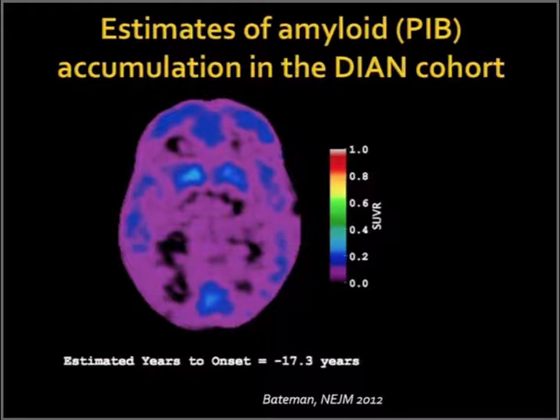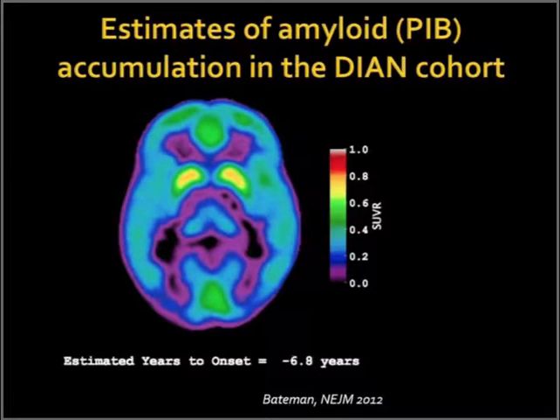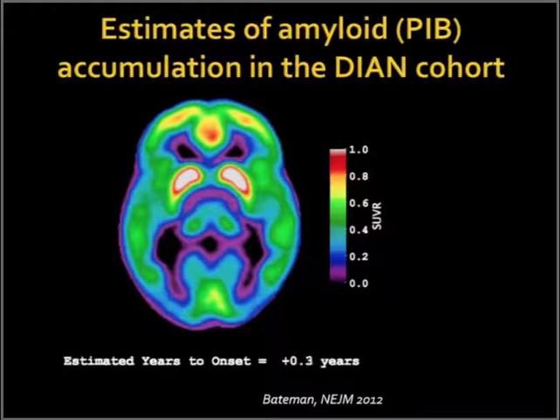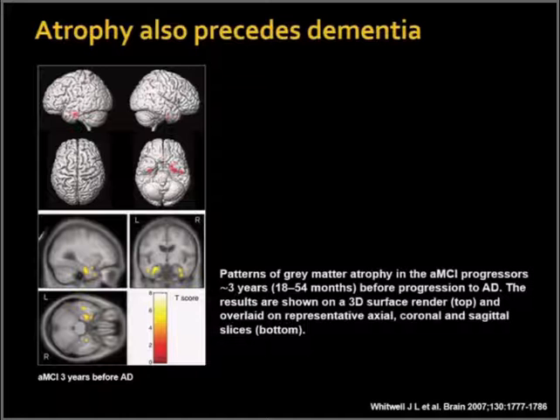We're about 20 years out, and you can see that amyloid accumulation growing. We're about 14 years out now. Now we're at that 10-year phase, and you can really see that amyloid accumulation that we're finding 5 years out still. And it's only now that we're entering that symptomatic stage of the disease. And what you start to see in these symptomatic years is, in fact, if you look carefully, not only are the ventricles more well-defined, but they start to grow as well. So we can actually even see some of that brain atrophy on our molecular PET scans, which is quite frightening. But this is the kind of data that's come together to really build support for these models of the concept of preclinical Alzheimer's disease.